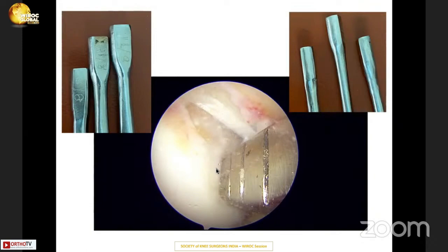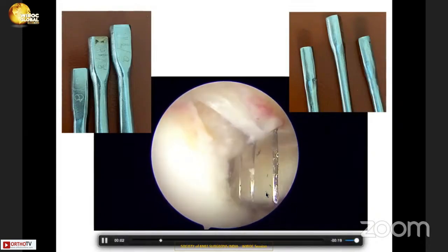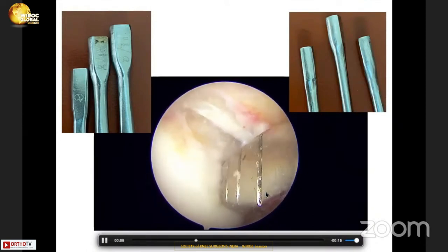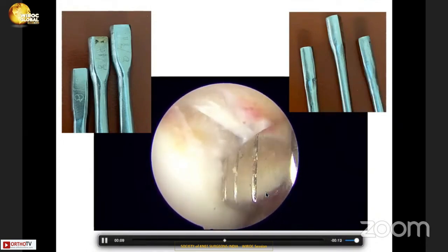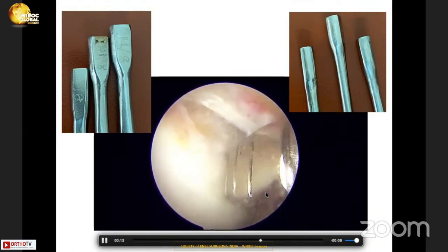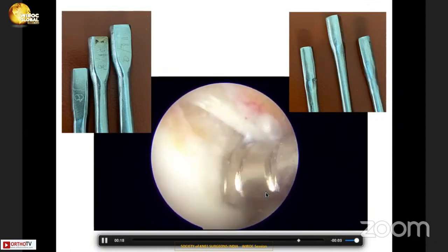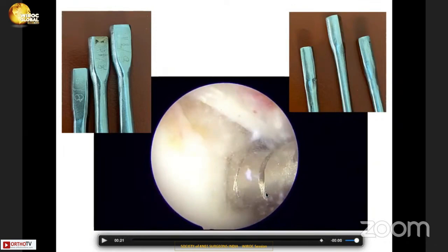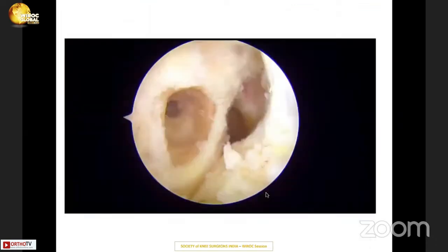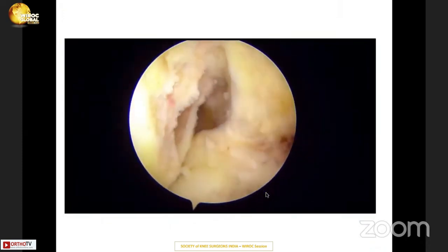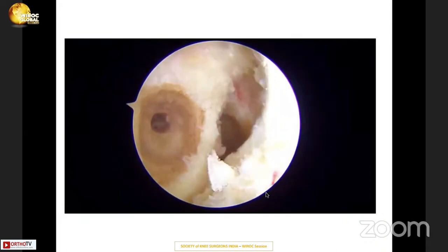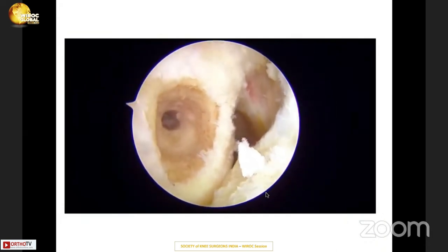If the graft is 9 mm, the dilators come in 9×9.5, 9×10, etc. Once you finish your circular tunnel through the same portal, you flex the knee and convert that circular tunnel into a rectangular tunnel depending on graft size. The dilators are marked at 5 mm increments so you know the depth — usually 15 to 20 mm depending on graft length. As each increment is only 0.5 mm, you tap gently, reducing the chance of posterior canal blowout. You can also slightly adjust the angle for a more oblique shape. Once finished, you can clearly see how the circular shape has been converted into an oval or rectangular tunnel on the femoral side, increasing the footprint coverage.